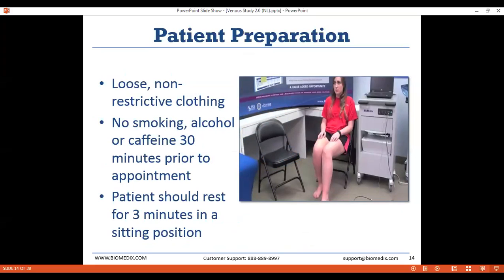The patient should be wearing loose, non-restrictive clothing to allow for maximum blood flow. The legs in particular should be exposed so the cuffs can be placed directly against the patient's skin on the calves. The patient should refrain from smoking, alcohol, or caffeine 30 minutes prior to the appointment. After entering the exam room, the patient should spend three minutes resting without moving or speaking in a sitting position, during which you'll want to enter the patient's information.